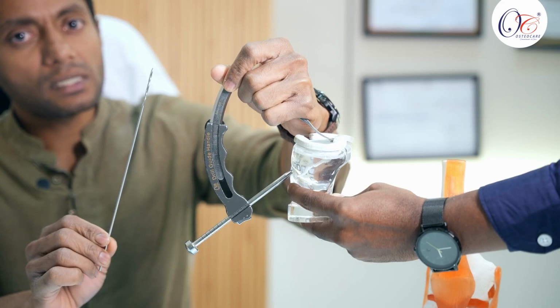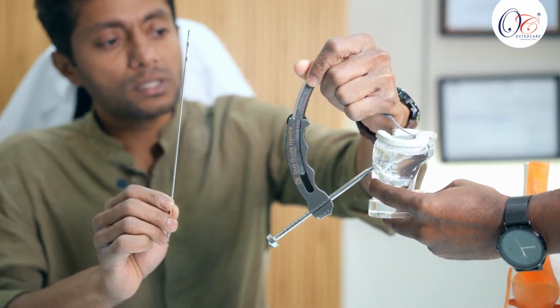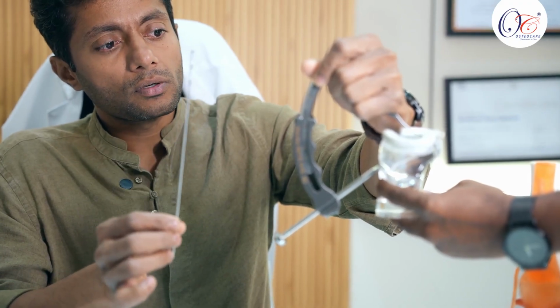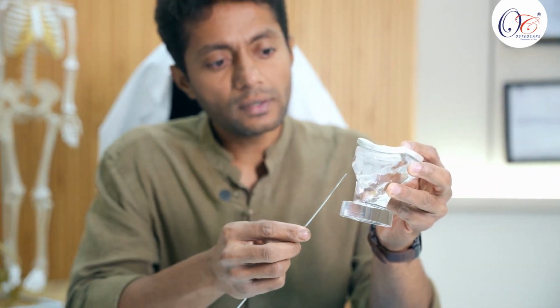Traditionally in the transtibial technique, we used to drill with a 5 mm or 4.5 mm drill bit, which is a cannulated drill bit, but this is just a 2.3 mm drill bit. So there is much less bone loss in this particular type of repair. So once the tunnel is drilled, we take everything out and then we use a cannulated sleeve as a guide to put in our metal loop.